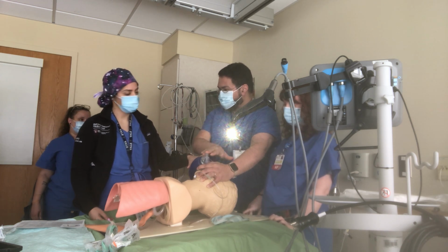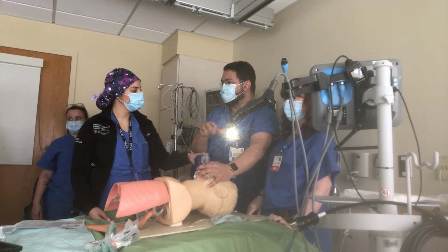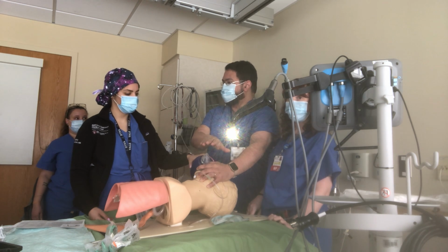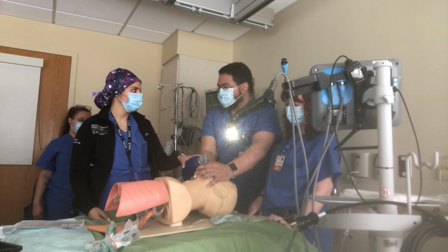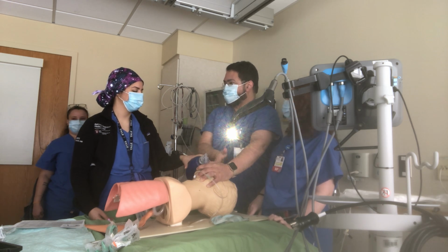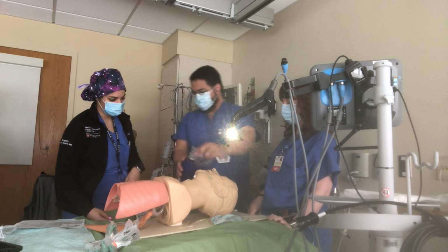So this point here sounds like it's not very important, but I forgot this a million times when I was young. That's something that you get by experience, that you have to stop looking at the toys. When you get the oxygen inside the patient, then you have time to work, right? If there's no oxygen, everybody's rushing you.